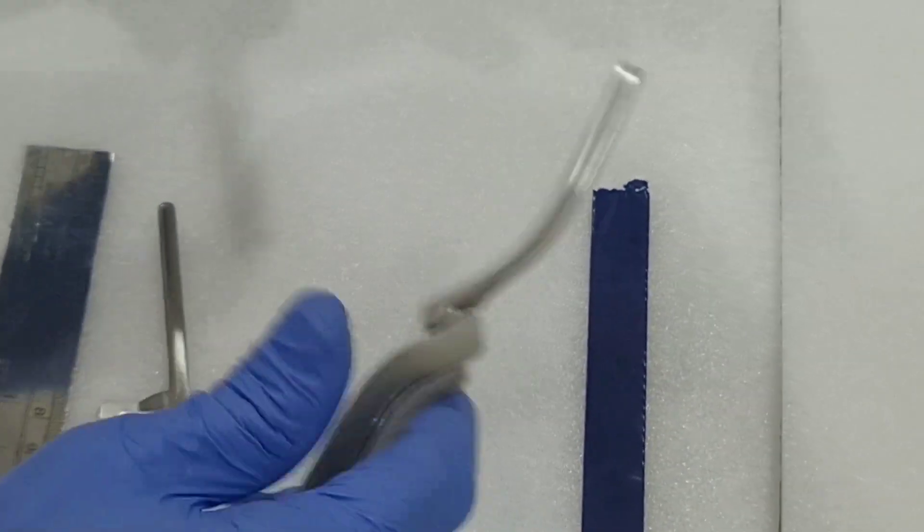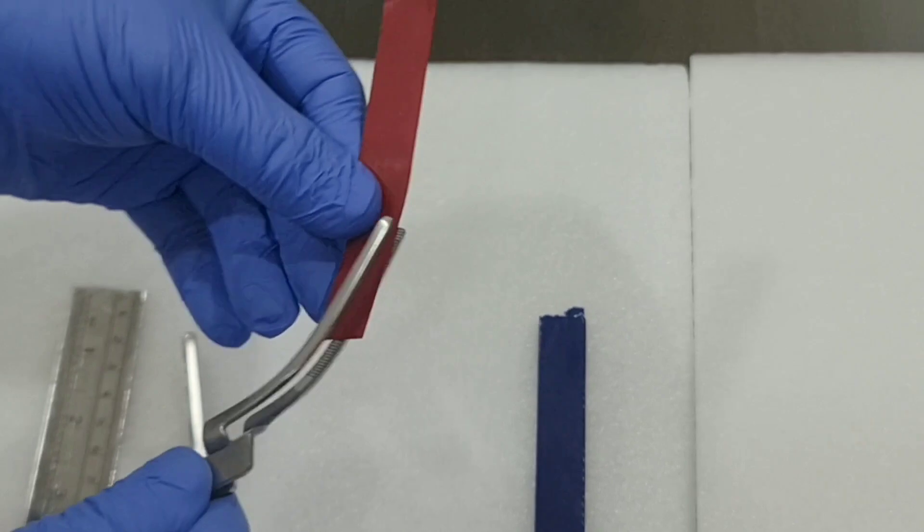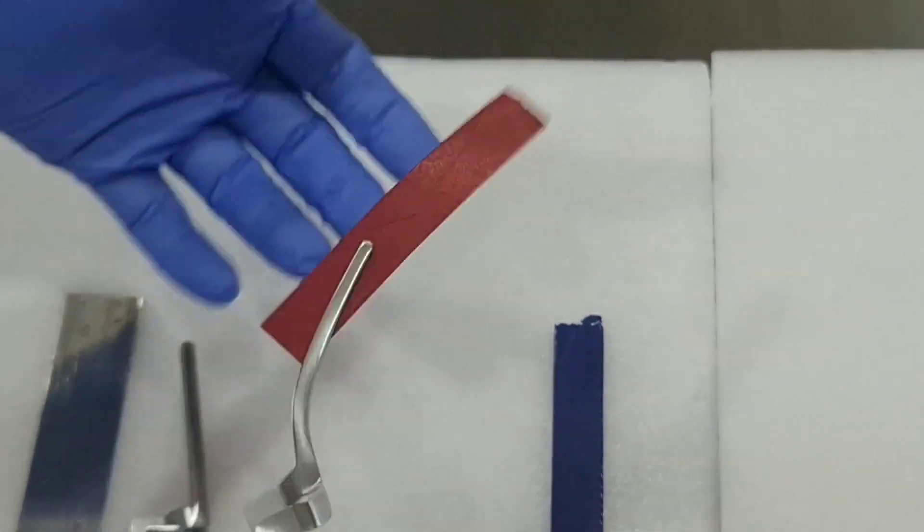For difficult areas to reach, you can use the curved articulating paper holder.